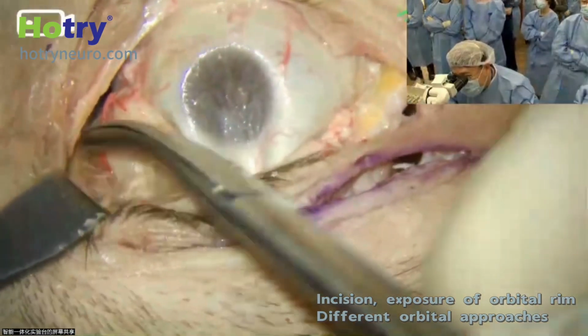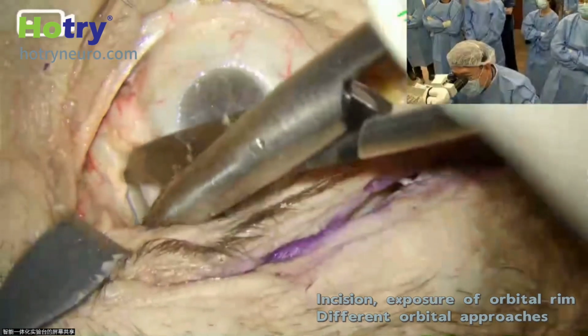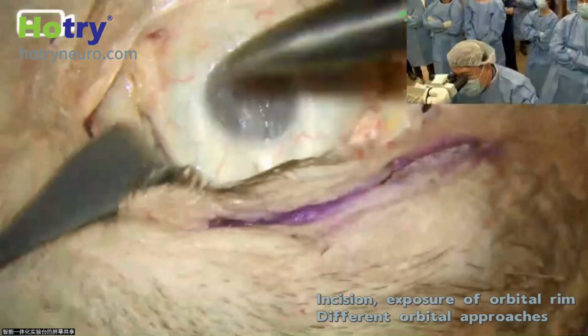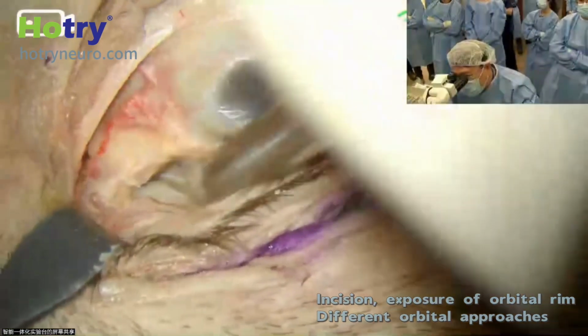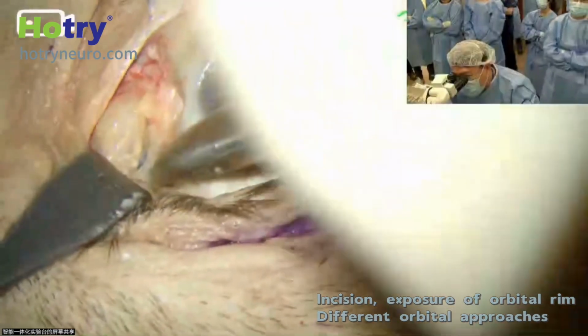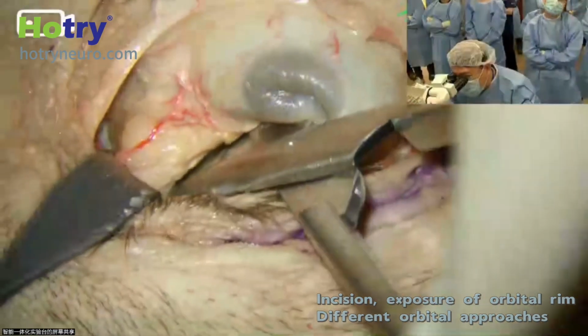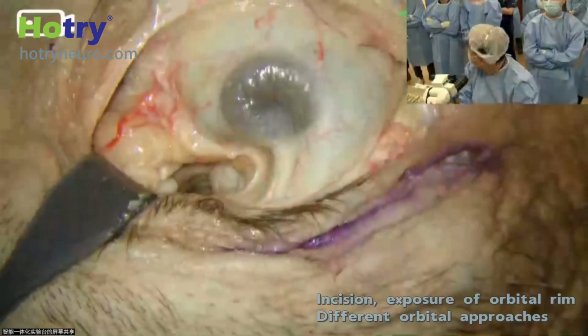Now, basically, just make it here, and then a blunt dissection, and then you can go into the orbit. And for a superomedially located lesion, we can put the endoscope inside this small incision to dissect the lesion out.